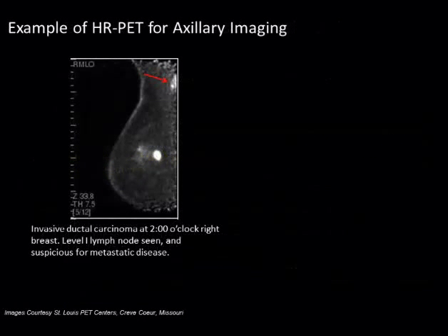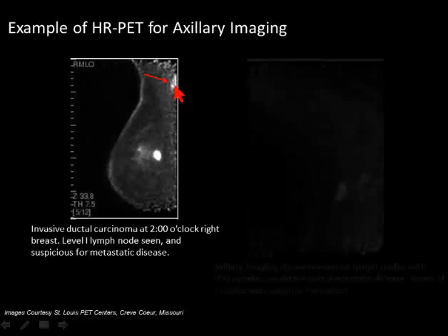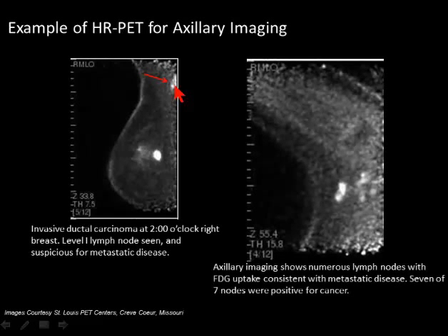What does it look like? Here you can see in this particular case we have an invasive ductal carcinoma. We have all of this DCIS in front of it. And in an MLO view, you can see the pectoralis muscle coming down here. It has the level of FDG uptake, which is actually lower than glandular tissue. So it doesn't keep you from being able to see those posterior lesions. And we can very easily see any kind of lymph node that is taking up FDG. But then turn the detectors around and actually interrogate the axilla. Here you can see sentinel, secondary, and tertiary lymph nodes. 7 of 7 lymph nodes being positive. That's important information to know before you go to the OR.